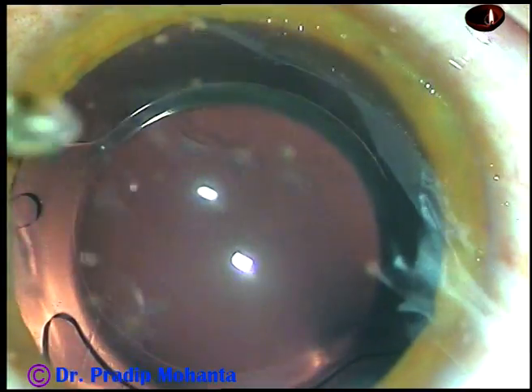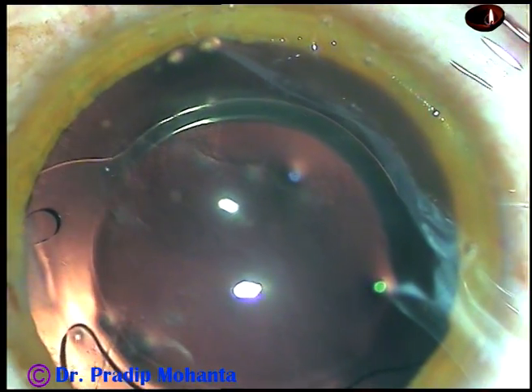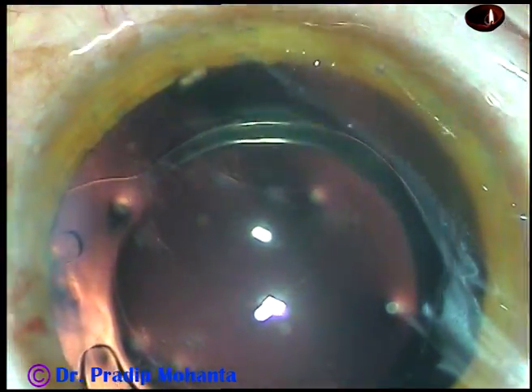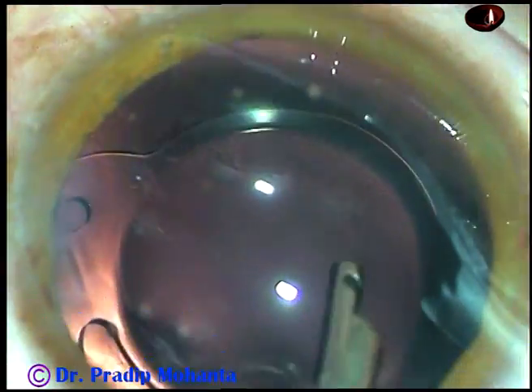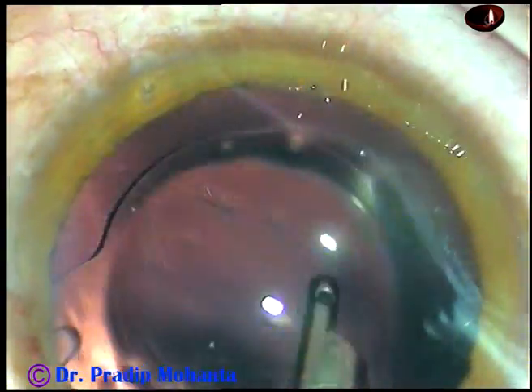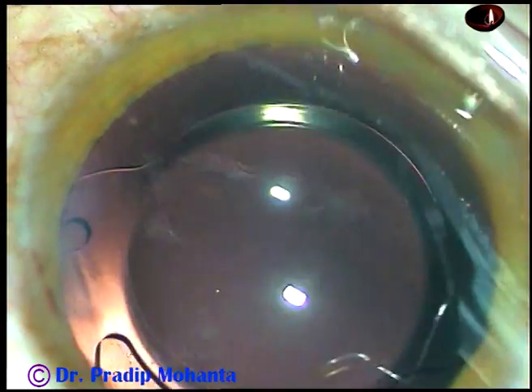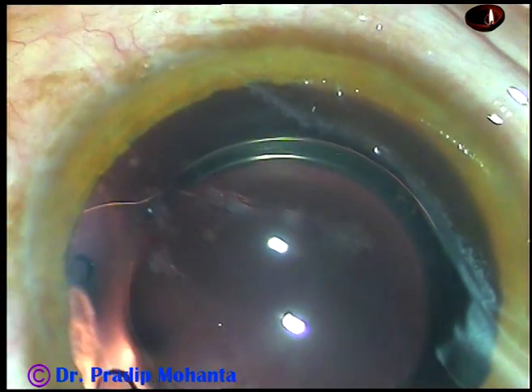Friends, this is a totally unedited surgery. So if you follow the right technique, and if you have a large volume of surgery, you find out ways to do it fast but in a safe manner. The only side port made in this case has been closed by stromal hydration. This is the final lavage of the capsular bag as well as the anterior chamber. The anterior chamber is formed nicely. The wounds are checked and the case is concluded.